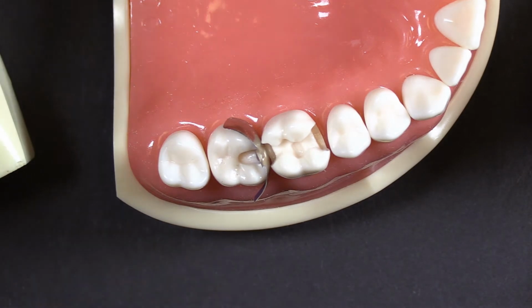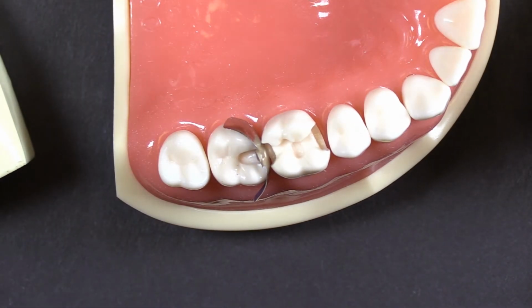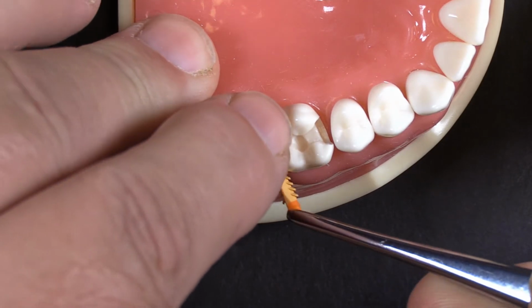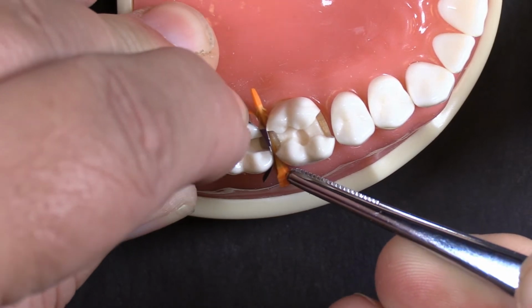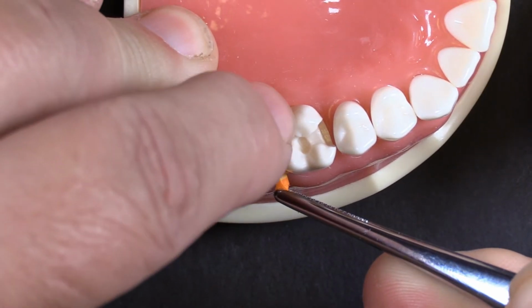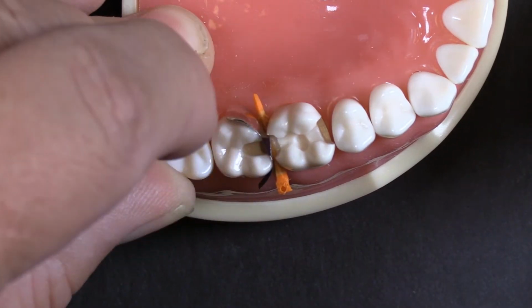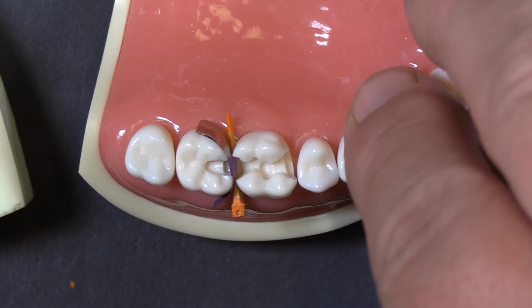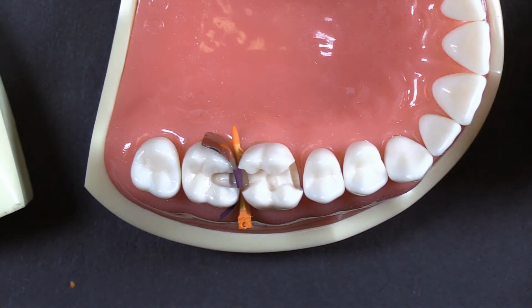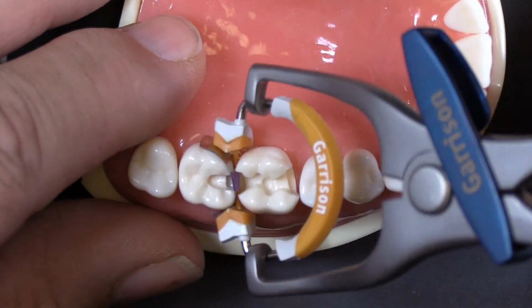and I'm not going through all the steps on placement here. I'm assuming that's kind of our beginner classes, when we're talking about placement of the matrix band and so on. So now I've wedged, and you saw the amount of force I was pushing on here. I wasn't driving that wedge in really aggressively. I just want that bottom sealed so that I don't get any crevicular fluid leakage on the bottom, but I don't need to separate the teeth as much, because when I apply the ring it is going to do that.